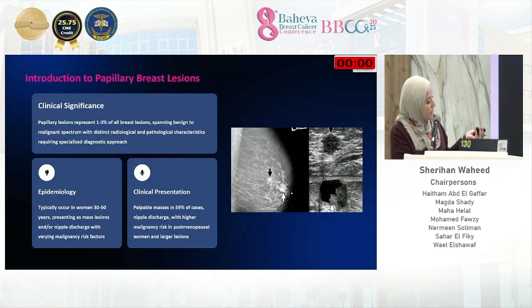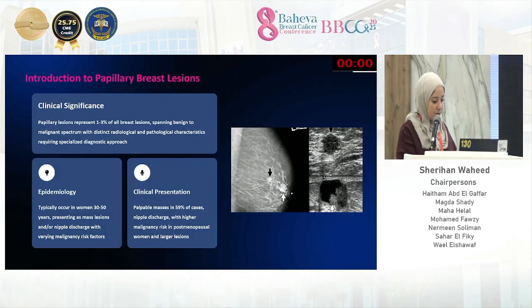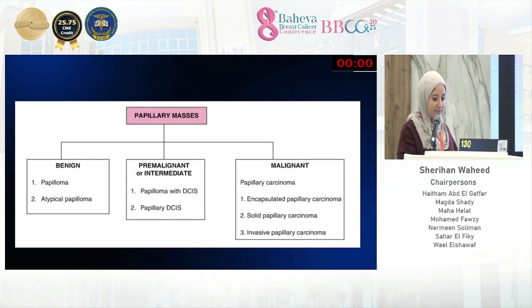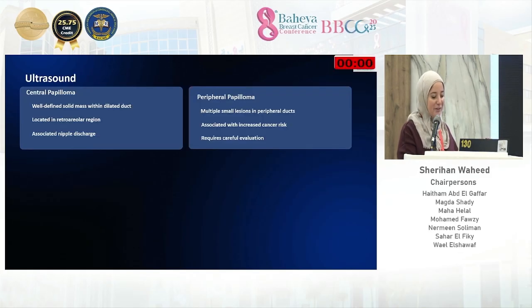Quickly moving on to the papillary lesions. These are lesions that represent 1 to 3% of all breast lesions, spanning from a benign to malignant spectrum with distinct radiological and pathological characteristics. They usually present as... Conclusion, please, Doctora. There are papillary lesions. I'll quickly show us the cases.